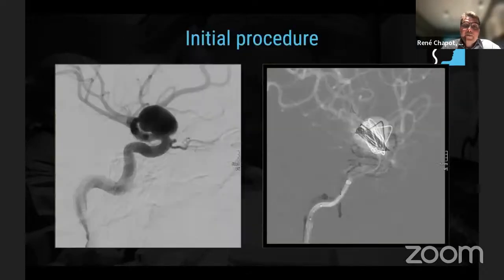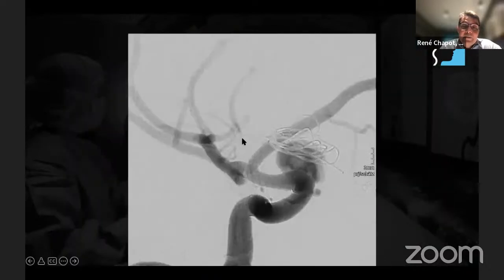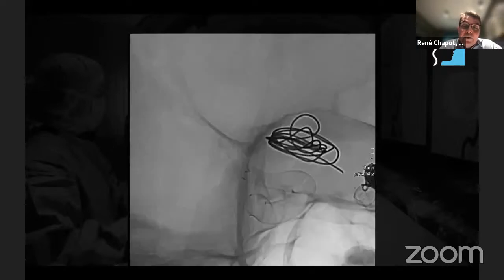Last point, and then I'm going to finish, is another situation where we have failures of flow diverters. I mean, endovascular physicians love to place flow diverters because usually it's not too complicated, putting potentially a coil, so treatment is being done, but the aneurysm here is growing. It's not done. You see that the coils are there, and this is still growing. So what to do here? Of course, adding other flow diverters, but experience shows that usually does not work as well as we would like.